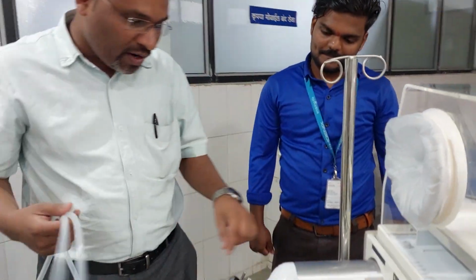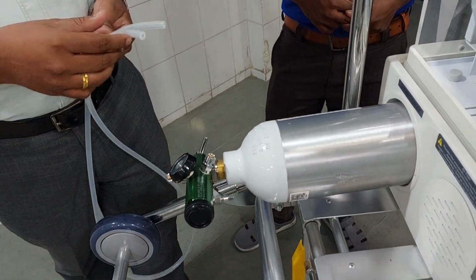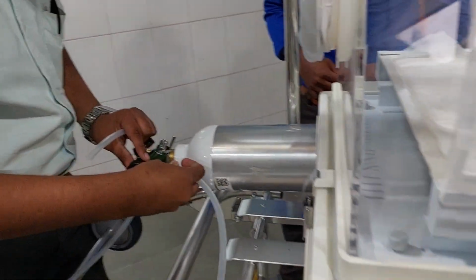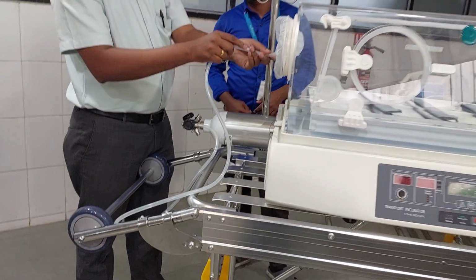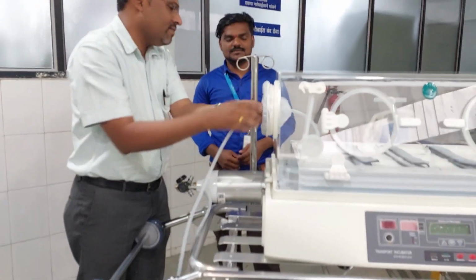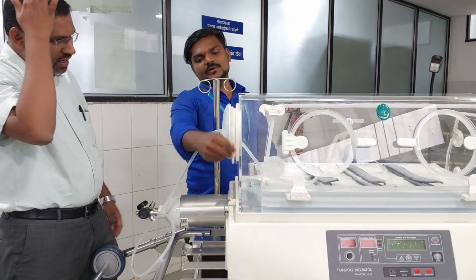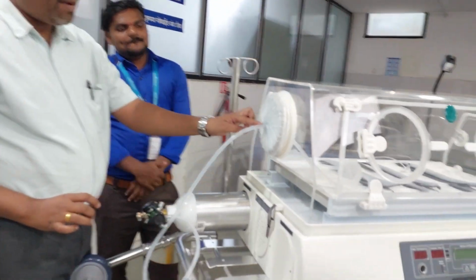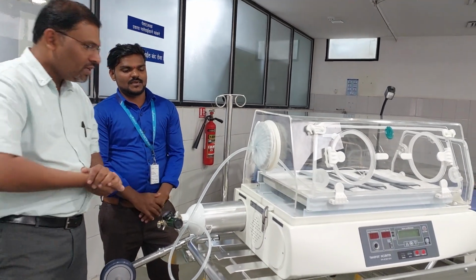Now they have provided these openings, high pressure oxygen and low pressure oxygen. Suppose for low pressure oxygen, you just connect one tube here, insert it with the help of this opening and just keep it here only, inside. After that, don't forget to close it, so it will get wrapped. That means there is no leakage of oxygen from the incubator.